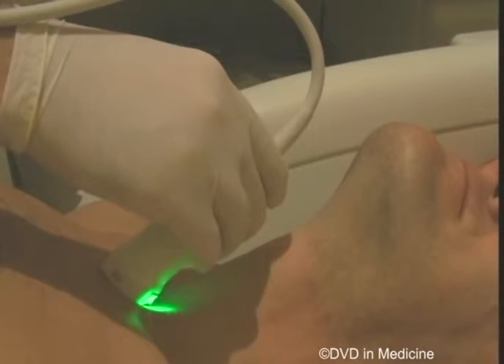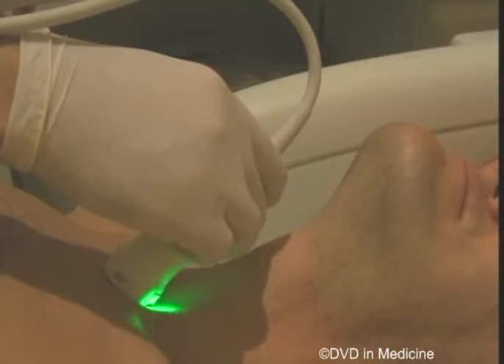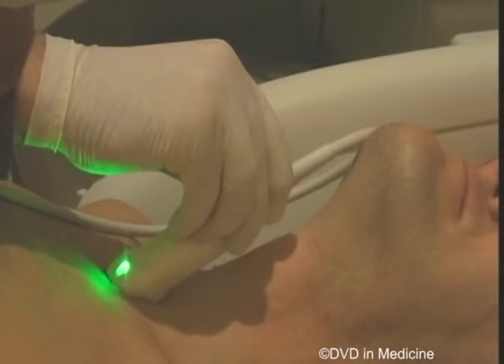From the suprasternal long axis view of the aortic arch, one should rotate the transducer clockwise until the cross-section of the aortic arch is obtained.